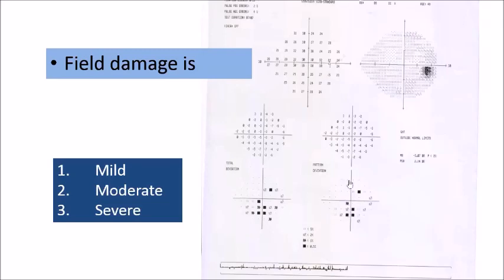But I want you to look here, this area with the mark, where you get sensitivity 28, 28, 25. If I depend on that, absolutely not, this is not the case. In the older systems, they will say severe glaucoma means that you have a value of 0 in one of the upper or lower parts, the central upper or central part, and they say moderate if you have a value less than 15 decibel. The values here didn't reach 15 decibel. 15 decibel up or down, this is moderate. 15 decibel both up and down, this is severe. 0, this is severe. This is the old system back in 1993.